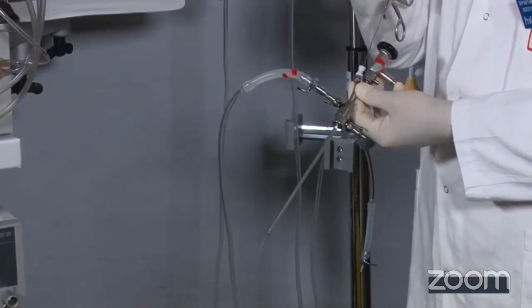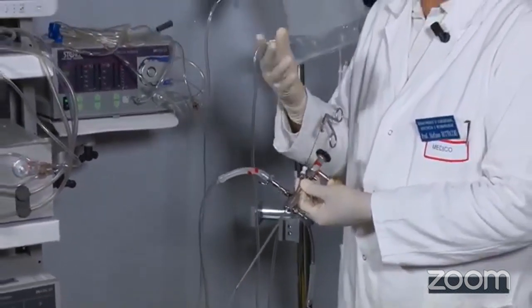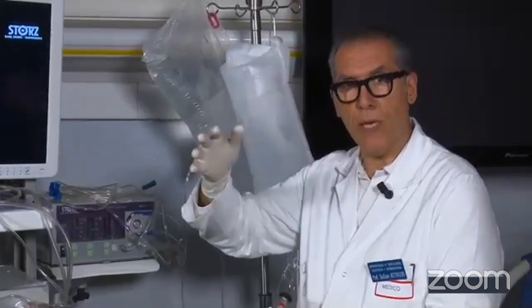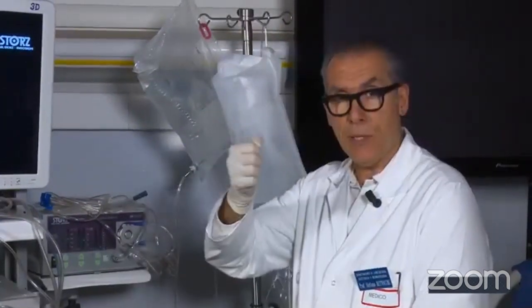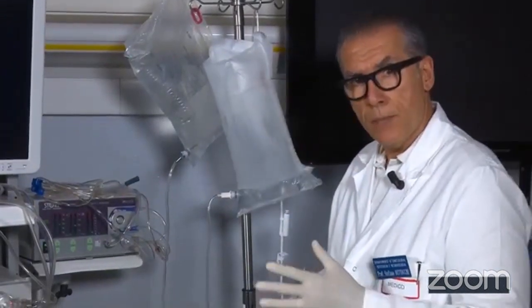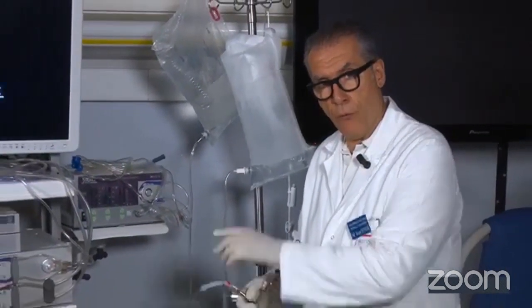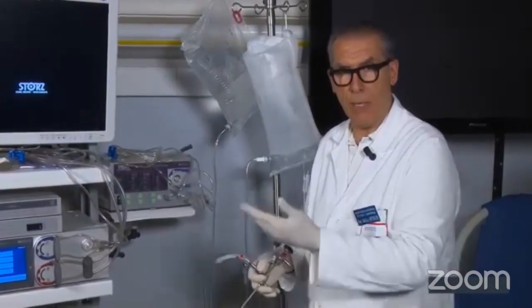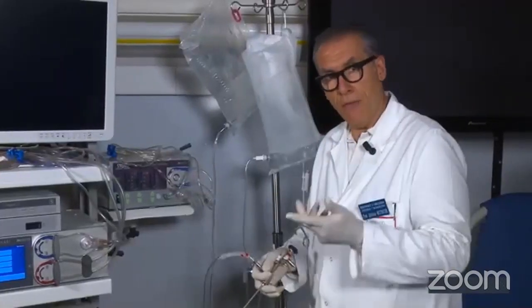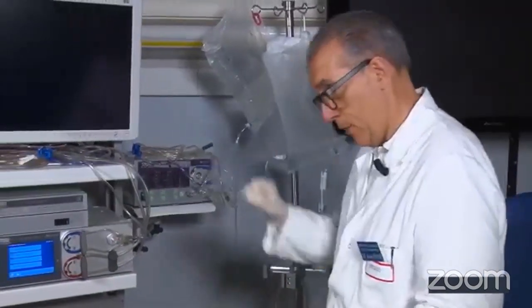This gives you the idea how difficult it is to manage the flow and therefore the pressure inside the uterine cavity. You know that the pressure is the balance between the inflow, so the amount of liquid going inside the uterine cavity, and the aspiration, the liquid coming out. So the physical laws that control these events are the Bernoulli and the Da Vinci law for the inflow, so the resistance, what I explained to you as a resistance for the fluid to pass through a channel. But it's not only this, this is the inflow. Then we have the outflow. And to explain the outflow, I have another example for you.